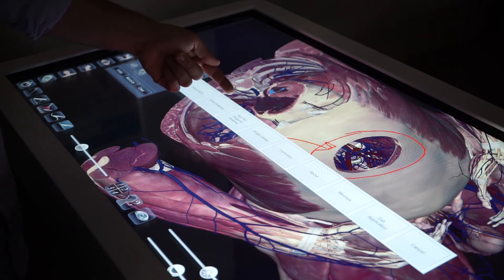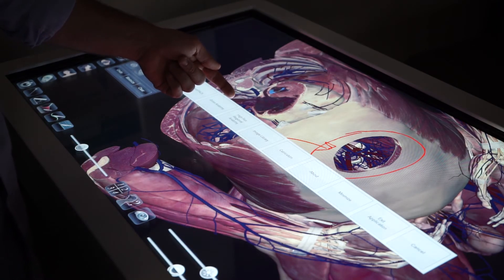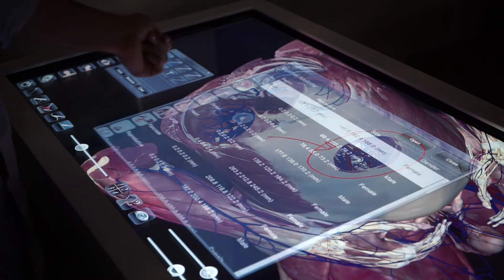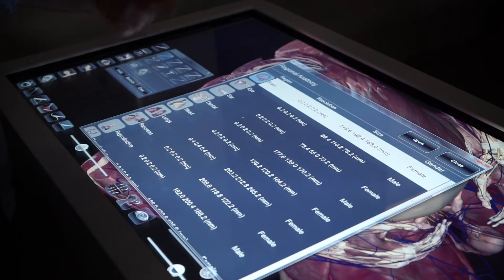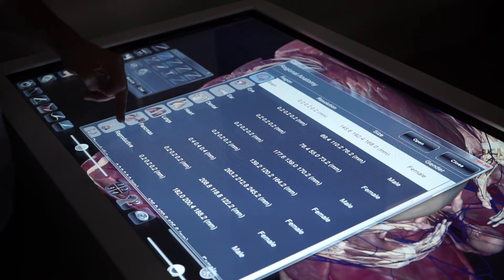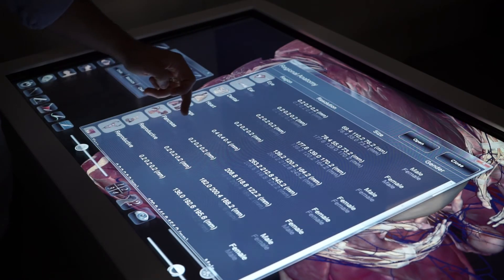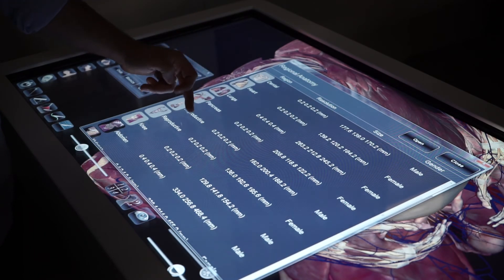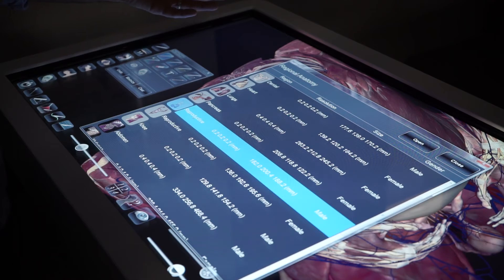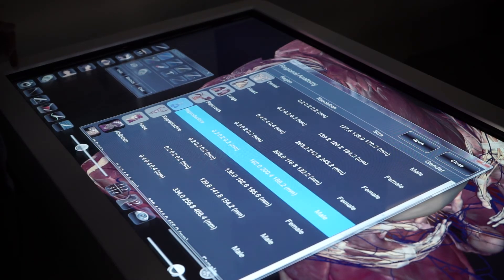This includes high definition regional anatomy. If I select that, I can see different areas, systems, or organs of the human body and select what I'd like to look at specifically.